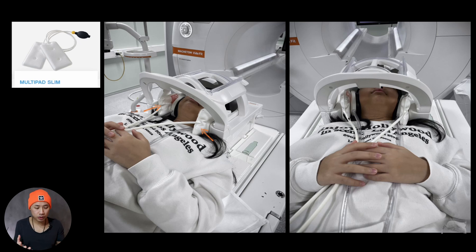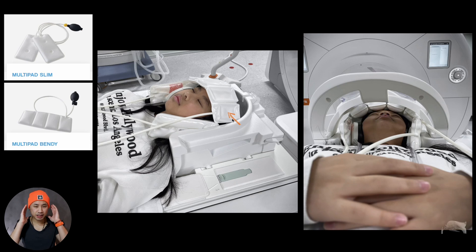It's reusable, easy to clean, and not radiographer dependent — every radiographer should be able to use this. You don't need to improvise to get the same results every time; it's very easy to use. When a patient is fixated on the sides so they won't move sideways, sometimes they'll also move forward. By placing something on the forehead and inflating that, you can achieve good fixation on both the sides and the forehead, making it much better for patients to lie still.